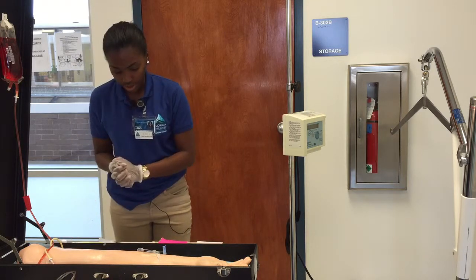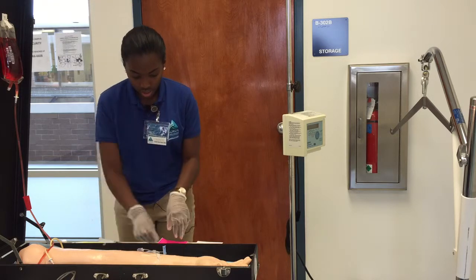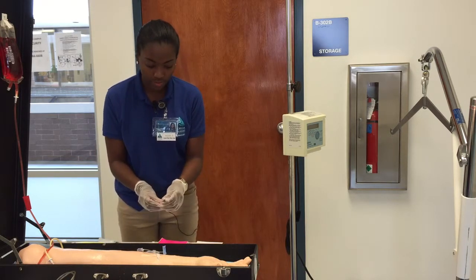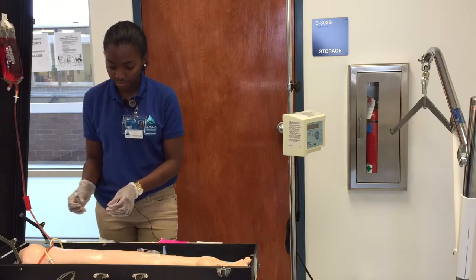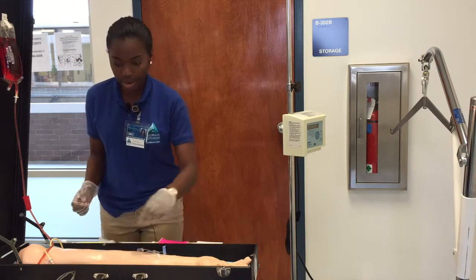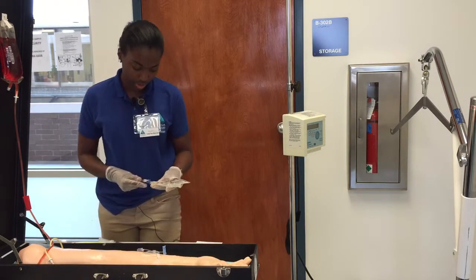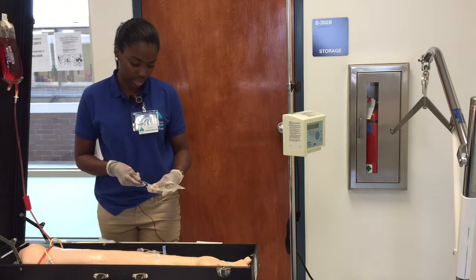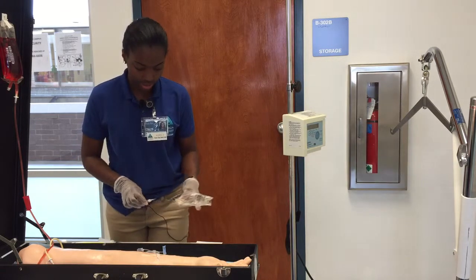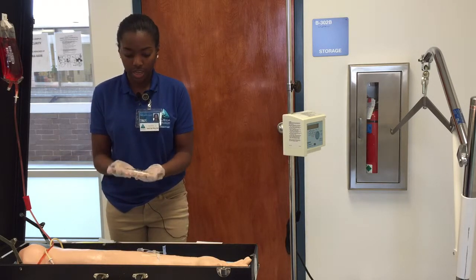Okay, and now I would administer my medication. And so I have my 0.5 mL that's already drawn up of my vancomycin, and I would insert it into my bag. Oh, it's right here. And so I'll put my 0.5 mL here. Okay. And dispose of my syringe in the sharps container, and I would swish the medication in.